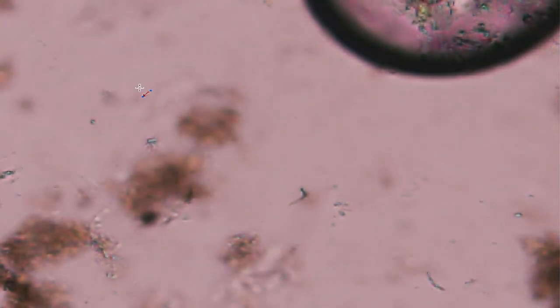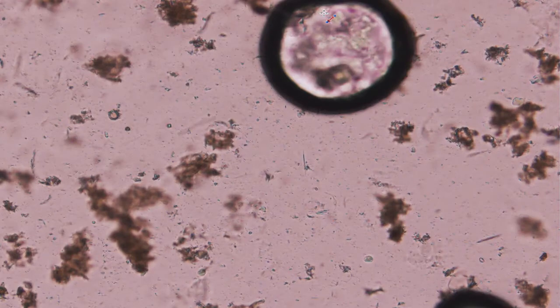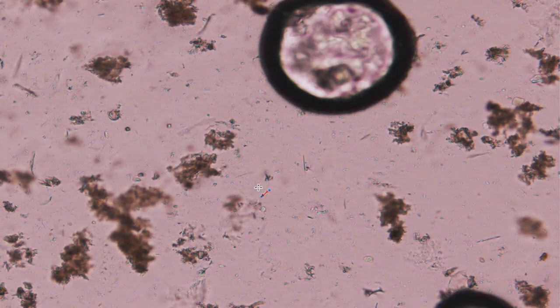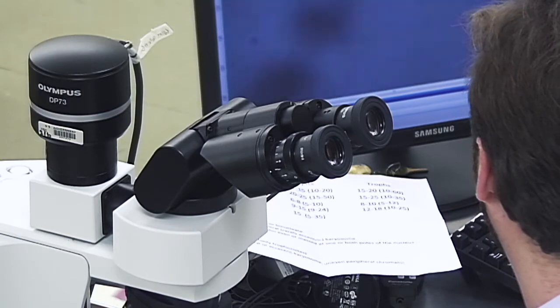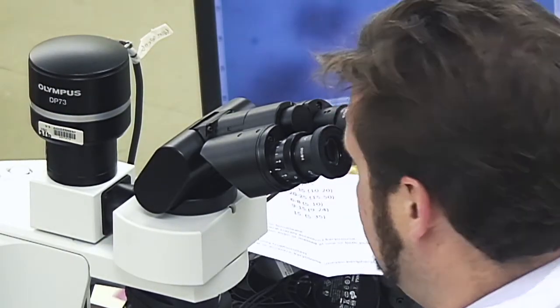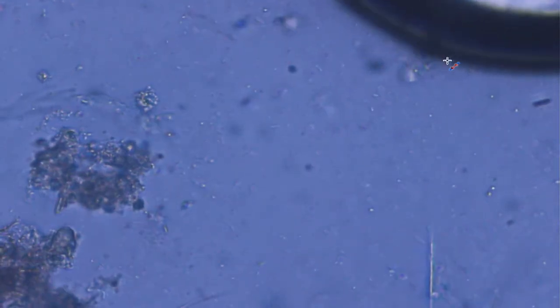Now I'm on low power here, on ×10, and something I want to show you is that you can often see the cysts on ×10, because they're quite distinctive. You see here these refractile round bodies, they're the cysts. They're quite distinctive even on low power, though I don't recommend screening on low power. Now we're down to ×40 again, and let's get this into view. And there we go. Let's now go hunting for those cysts that we saw earlier.